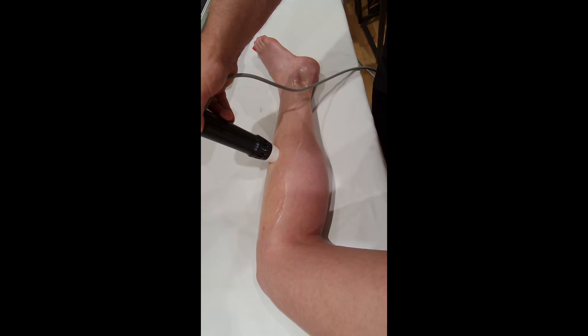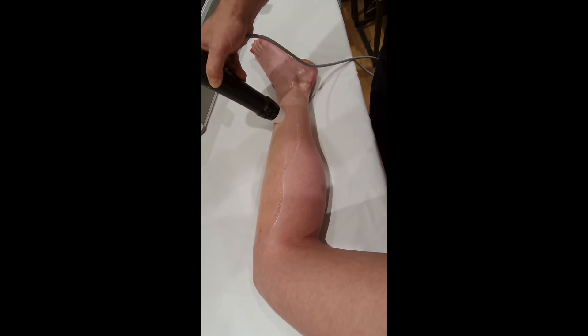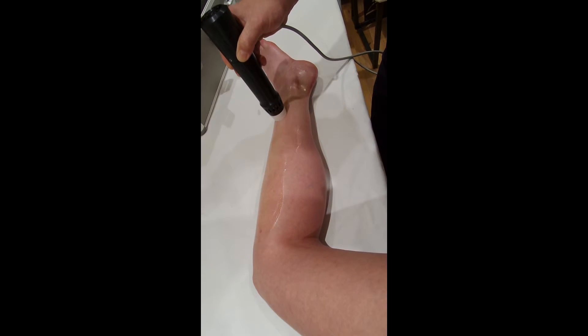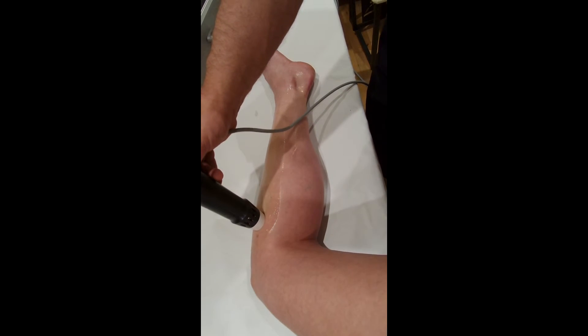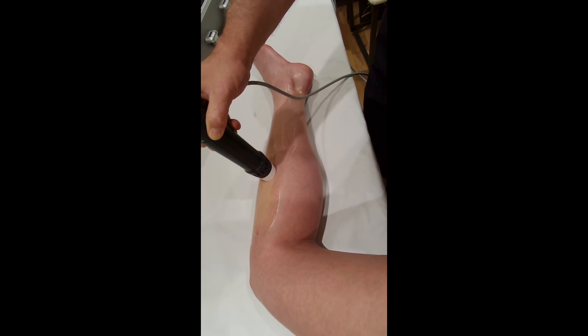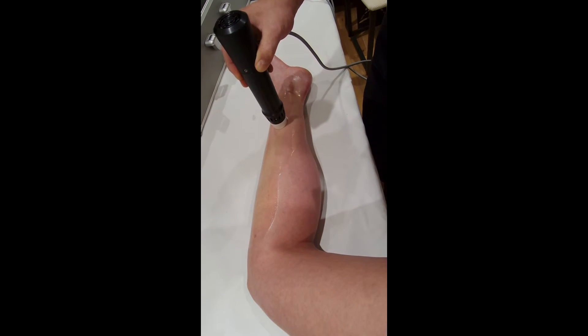From the literature we know that most radial shockwave machines will go in a maximum of about 3.5cm — just over an inch — into the body. That's going to be more than enough for the peroneal muscles in this case. So I don't see a lot of point in pressing the head into the body and almost using the head like a second mechanical massager.